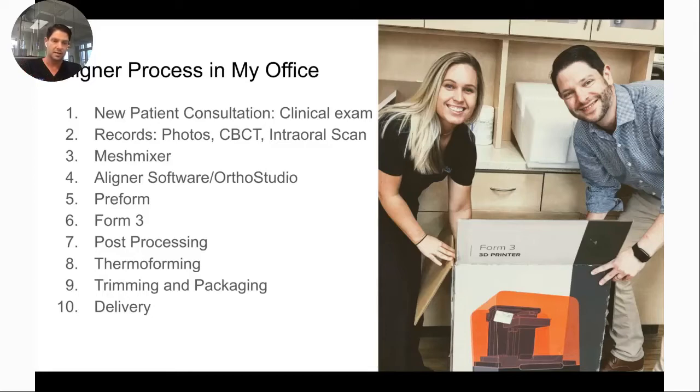Because most of the time, it's not the doctor doing the printing. It's usually the assistants in the office who are responsible for putting the files in PreForm, hitting print, post-processing the print, and getting things ready for the patient. So user friendliness, as a side note, is really important in a dental office. At that point, most of my models now are printed on the Form 3. They're then post-processed with an alcohol bath, and then cured.